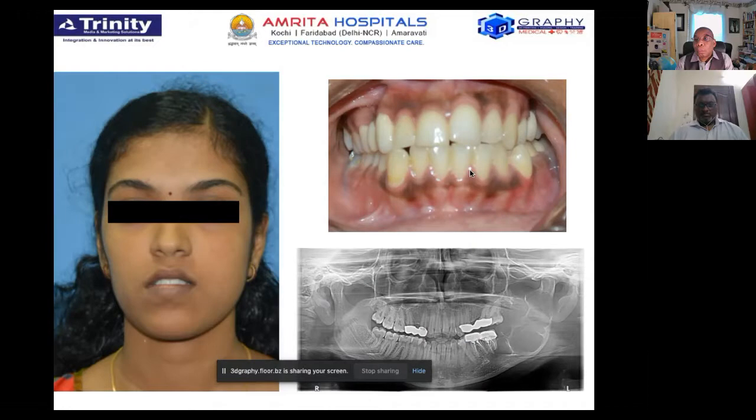Another case where the mandible along with the condyle was resected. So in this, we thought that we should go ahead with a custom plate with the condylar head and treat it as an extended TJR.